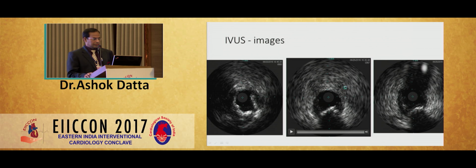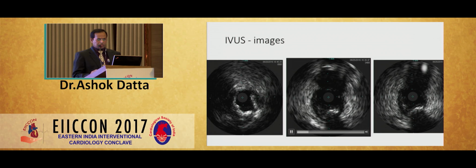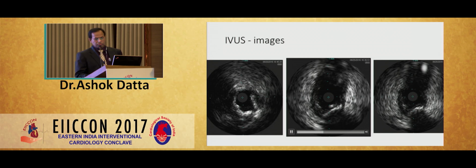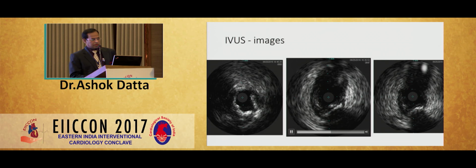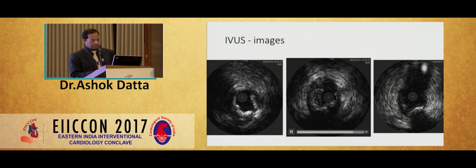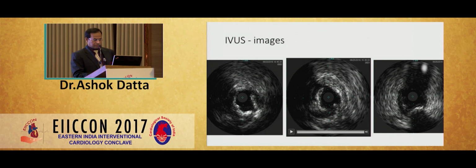So now IVUS: you see a lot of calcium in the left main, more than 180 degrees. On the right, the LCX ostium was good. So plan to put a stent from left main to LAD.